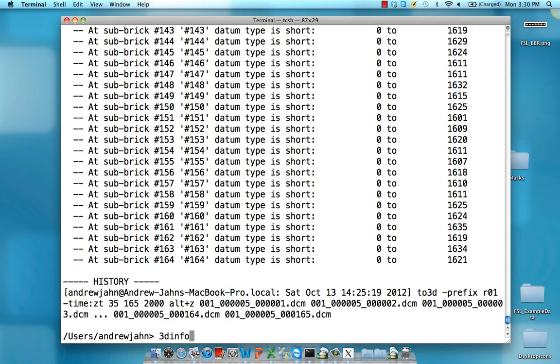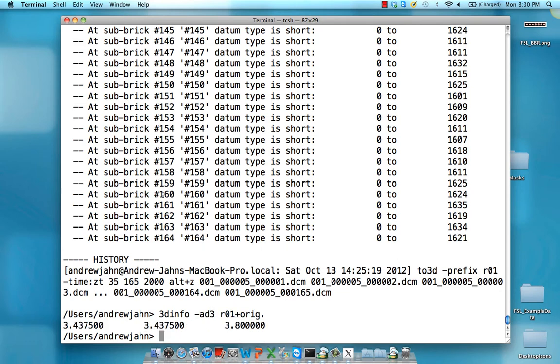3dinfo can also be used to quickly grab information about the voxel information. For example, using the -AD3 command returns the size of the voxel dimensions in the X, Y, and Z directions.